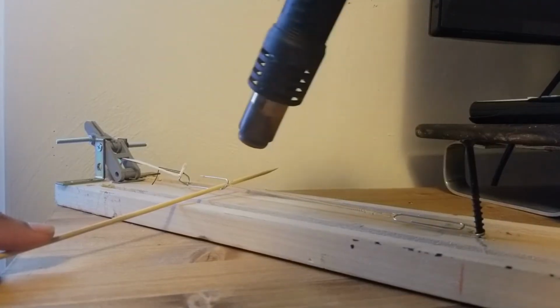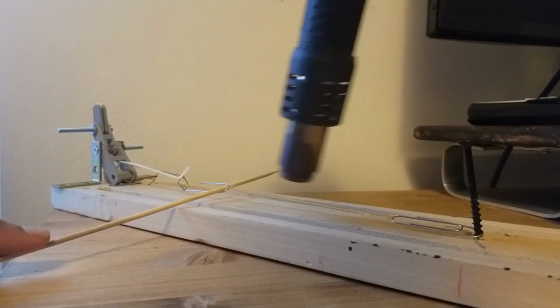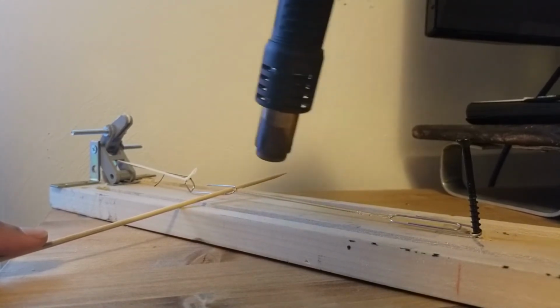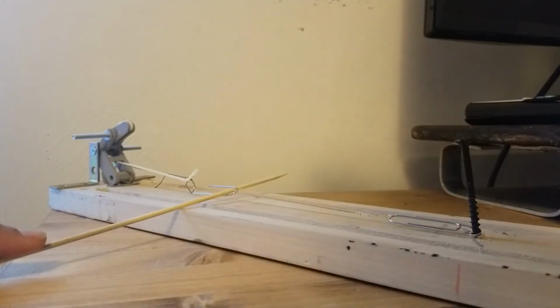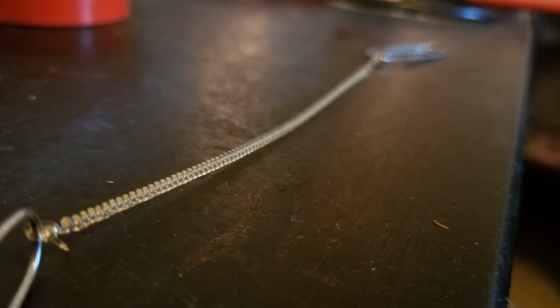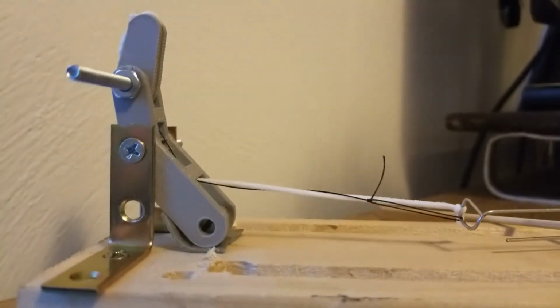Next, we have the artificial muscle. And as said before, the purpose of this is to advance prosthetic hands, but also give someone living with limb loss a more real experience with their prosthetic hand. So you don't hear motors whirring around and all these weird sounds. And also the artificial muscles, in this case, tempered supercoiled nylon fishing line, are stronger by mass than a motor that could fit in the same size hand.